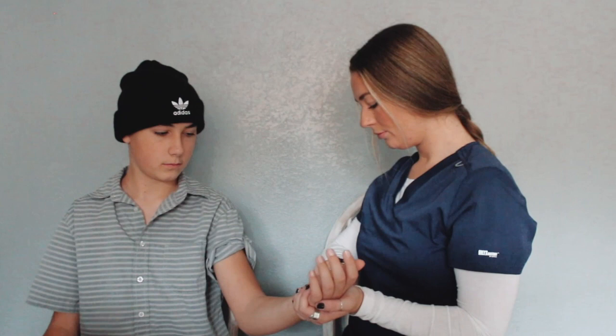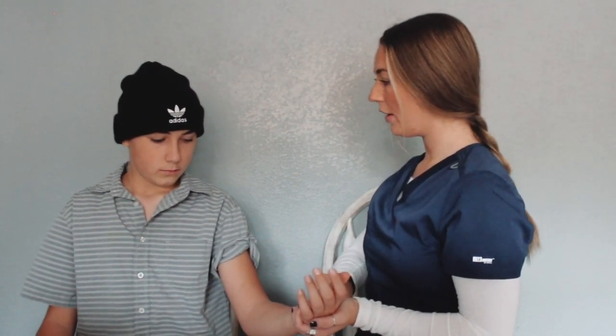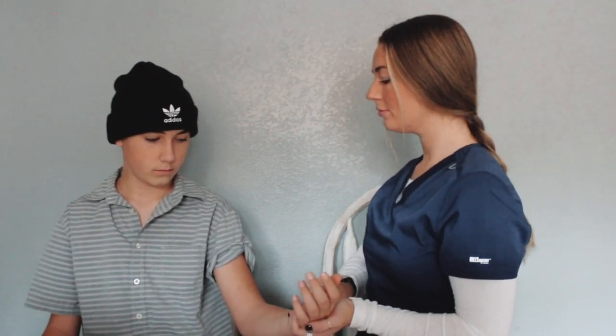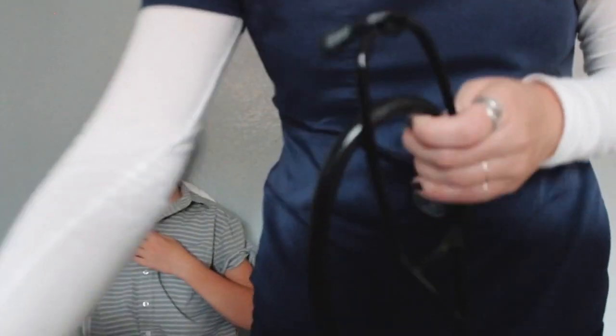Now, on to respirations. We will perform this skill immediately after taking pulse rate. Here is the fun trick: if the patient knows you are counting their breathing, it may cause their breathing to become irregular. We will keep our fingers placed on their wrist while following the second hand on our watch for another 30 seconds and simultaneously count their breathing. It's helpful to look at the patient's chest rise and fall. Each breath counts as one full inspiration and one full expiration. You have properly counted your patient's respirations without them knowing. We will then take the number of respirations we got in the span of those 30 seconds and multiply it times two, giving us the number of breaths per minute.